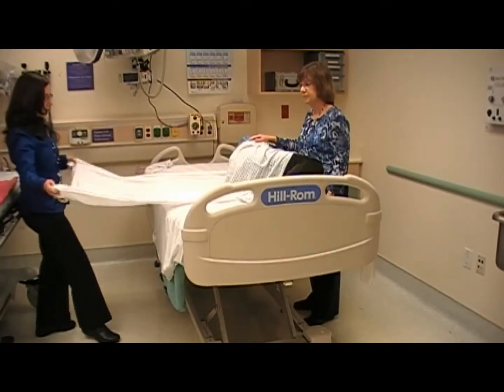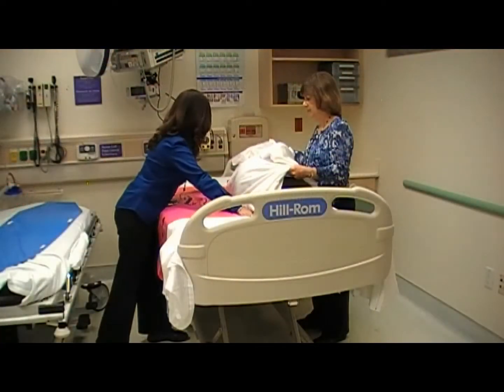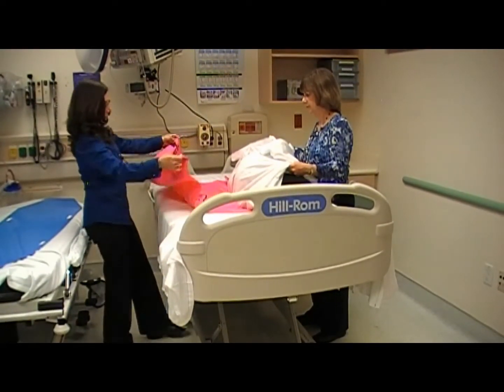When doing a lateral transfer, position the draw sheet with the longer length on the side you will be pulling from. Insert the pink slip with arrows pointing from side to side, the direction of patient movement.